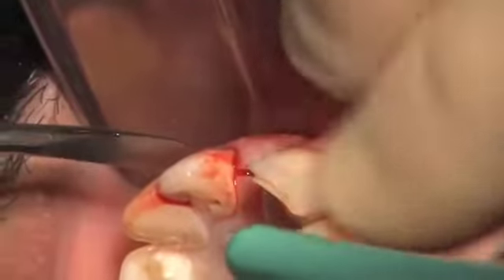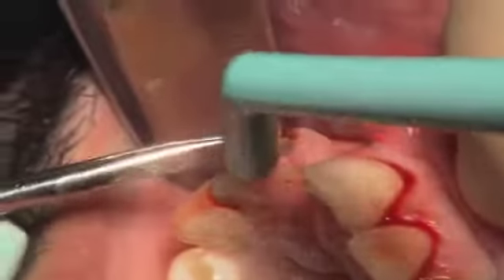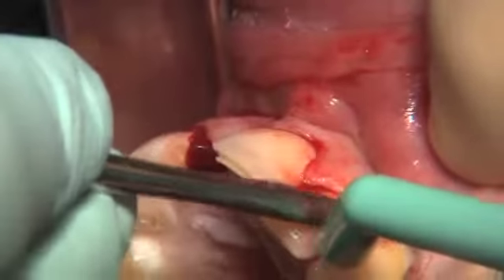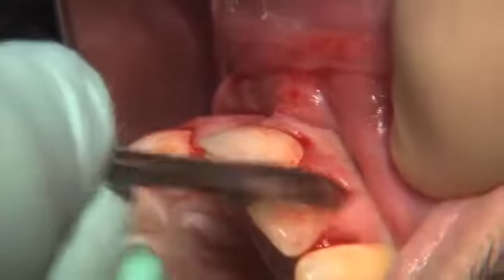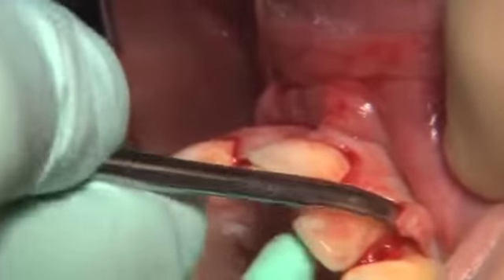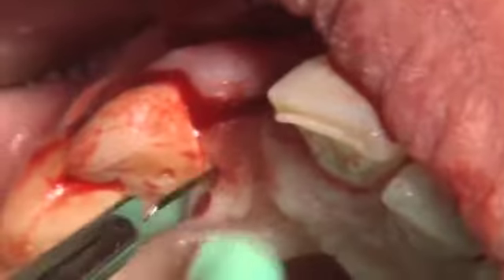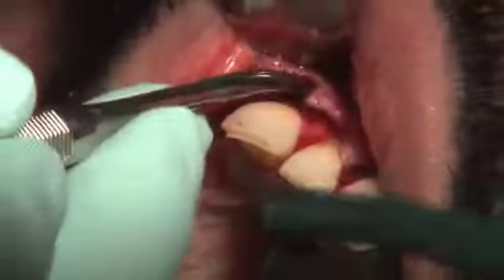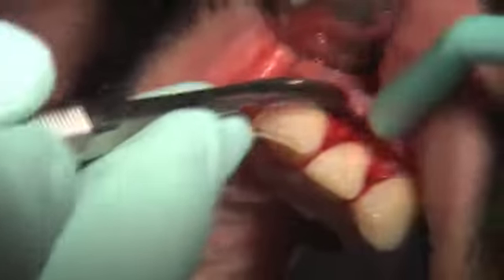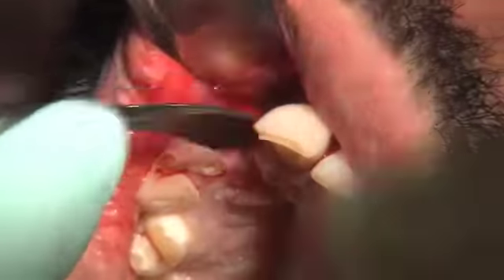Once the incisions have been made, the tissue is bluntly dissected back utilizing the blunt end of a periosteal elevator in this case. Again, extreme care must be taken so as not to damage the flap itself or compromise the blood supply in any way. Once the buccal tissues have been released adequately, a small incision can be made around the lingual of the teeth on either side of the proposed osteotomy site, again being cognizant in this case of the incisive canal between 8 and 9. Gentle pressure is applied to reflect the palatal tissue.